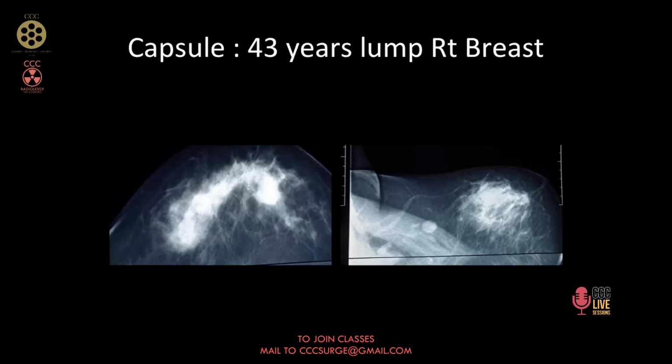So if it is an extratumoral microcalcification, then it is likely not to be taken up for breast conservation therapy. Now look carefully. Here you will find small pleomorphism. This is a patient with a multicentric lesion, and therefore, again, breast conservation is not feasible. But as I said, you need to magnify it 10, 20 times in the computer to look at this microcalcification, or else you are going to excise this and the patient is going to come back with a recurrence here, or the margin is going to come out positive if you are not looking at this clustered microcalcification.